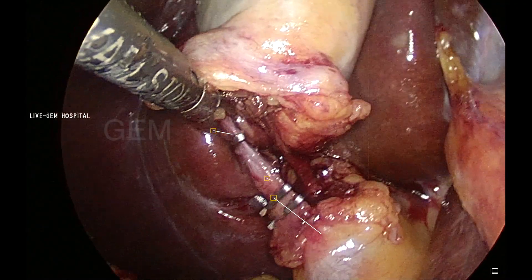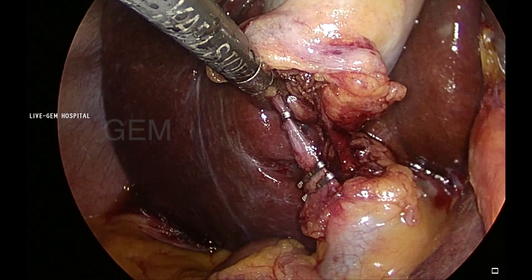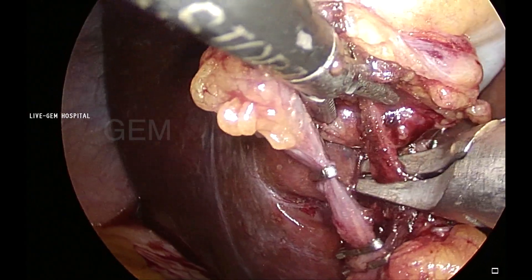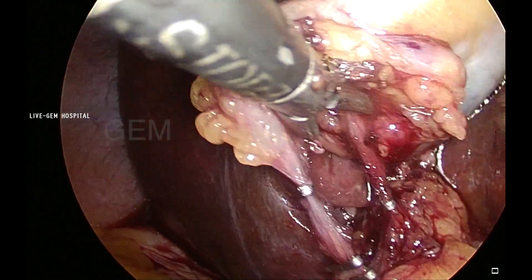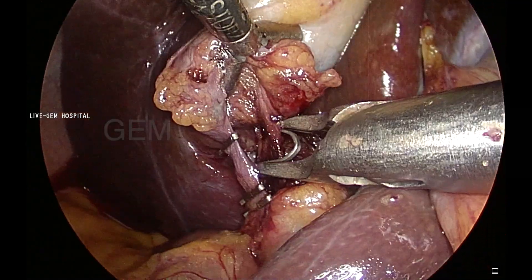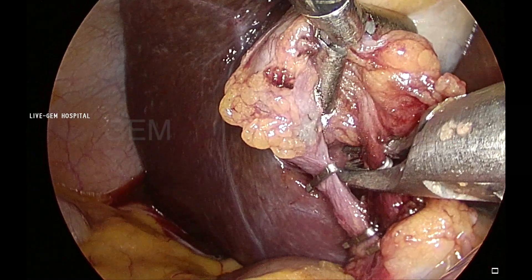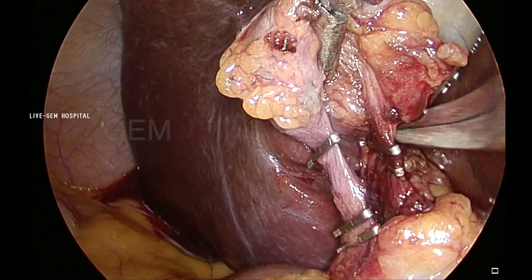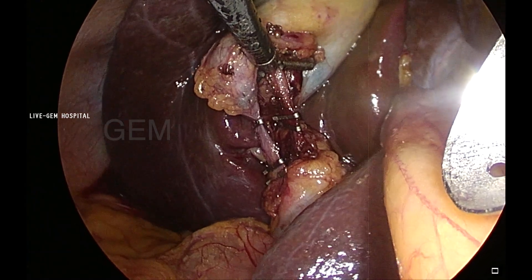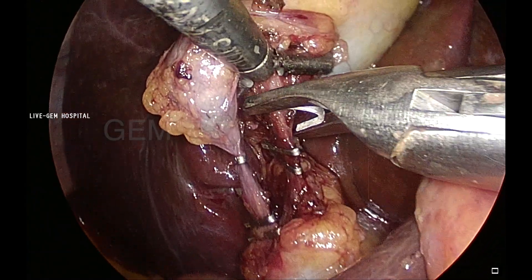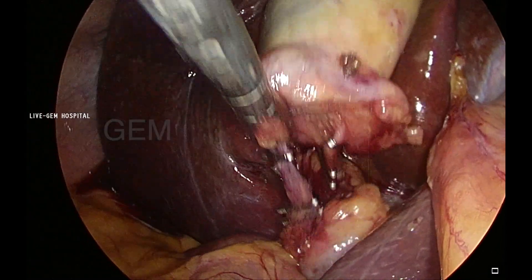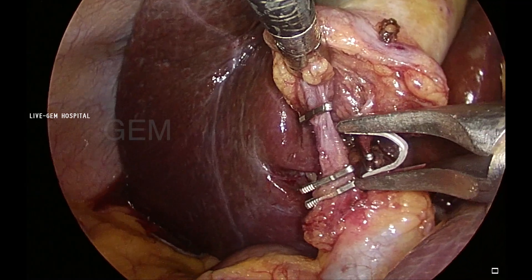Regarding division of artery first versus clipping — you can do either cystic duct or artery first. But the division of artery must be done first because once you divide the cystic duct, if accidentally giving traction with the left hand, the artery will get avulsed. That is why after clipping, the artery is to be divided first. One trainee in a training course told a nice way to remember: ABCD — Artery Before Cystic Duct. You have to divide the artery before the cystic duct. Now I apply the clip — so I have to divide the artery before dividing the cystic duct, and these two clips are very nicely applied.